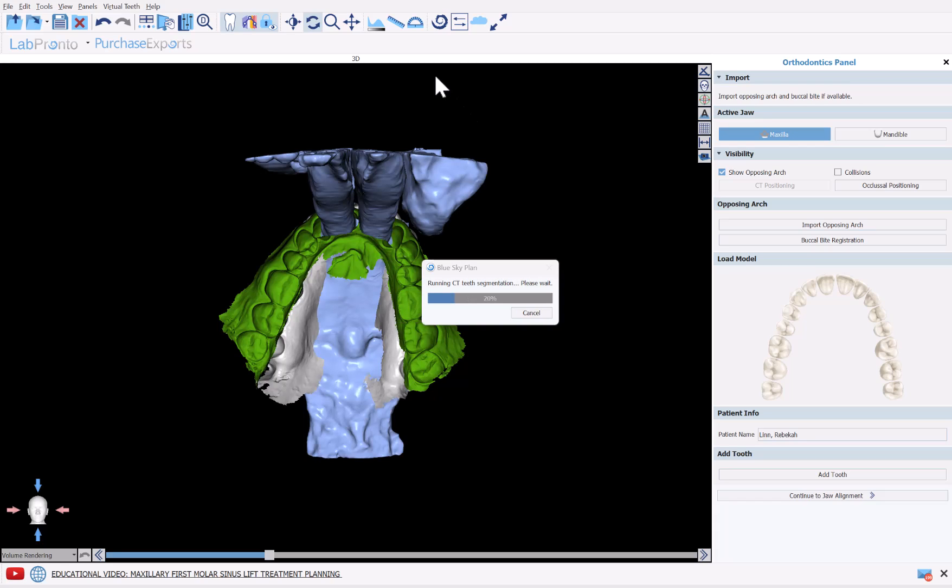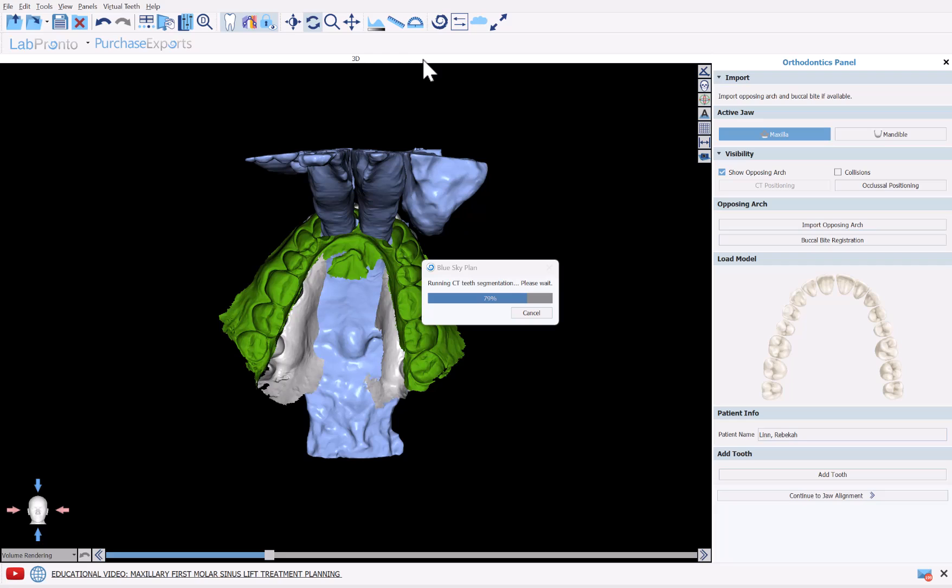The software is now proceeding with its CT segmentation. We have designed the process flows so that all the automatic detection happens sequentially automatically. So you can let the software run, go grab a cup of coffee, see a patient, and then come back and the processing will be done. I will also show you where you could set your preferences in terms of which automated processes should run when you load a new patient and the CT scan.